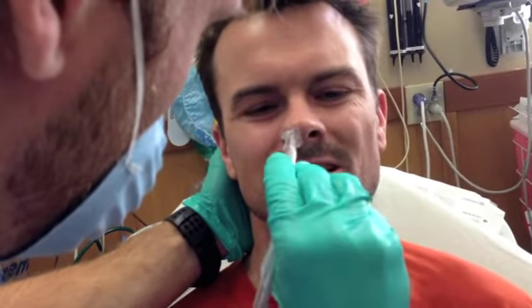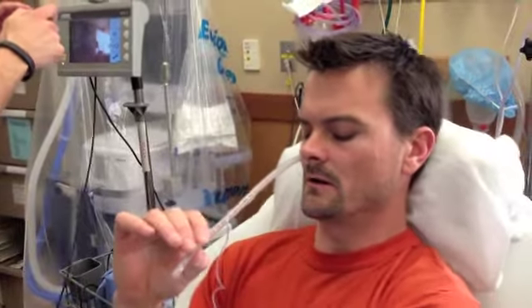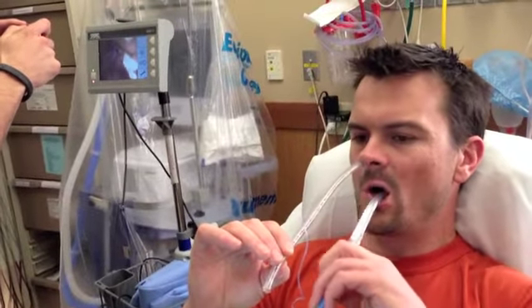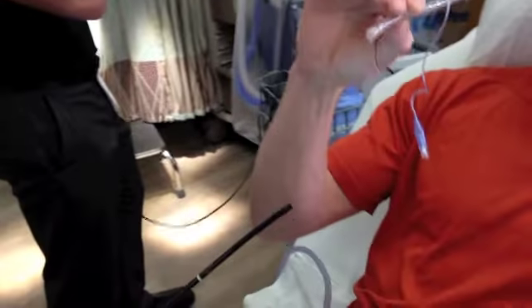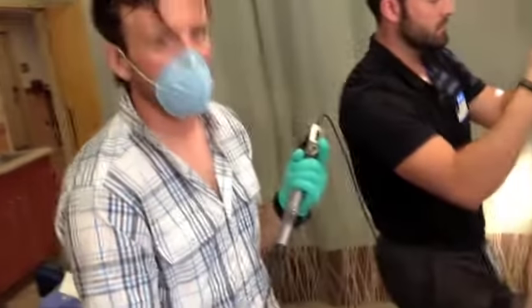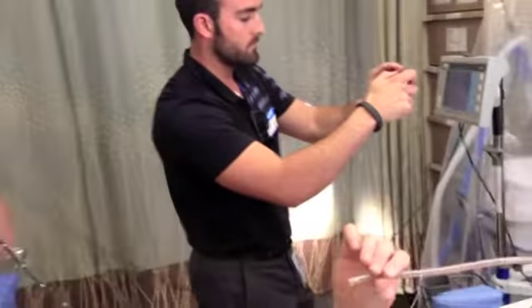Okay, that's good. That's really good right there. For the purposes of this video and Clay's comfort, we're not going to insert the tube all the way. But normally I would recommend inserting the tube so the end of it is in the posterior pharynx. It'll just make this a lot easier.